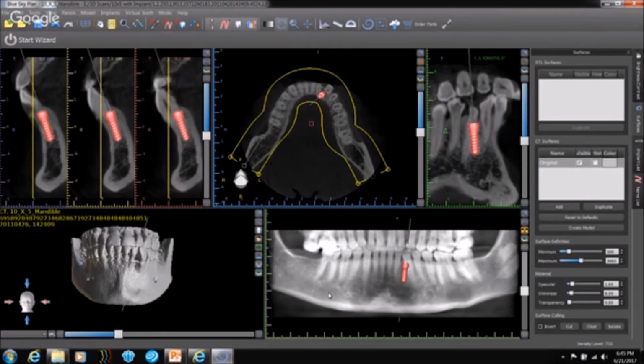In fact, the CBCT will yield better results because there's no way that you can get a 1 millimeter or a sub-millimeter scan out of a regular MDCT. So to answer the question, it is reliable. All measurements made on CBCT are one-to-one. There's no magnification factor or adjustment factors. On a regular CT, the slice thickness would be much higher, and you use a certain mathematical scale to interpret those images. That problem does not exist with CBCT at all. So it is absolutely reliable, and it is the way to go.